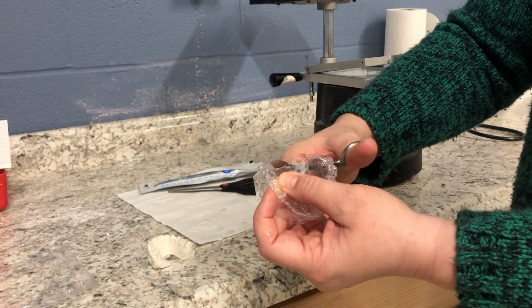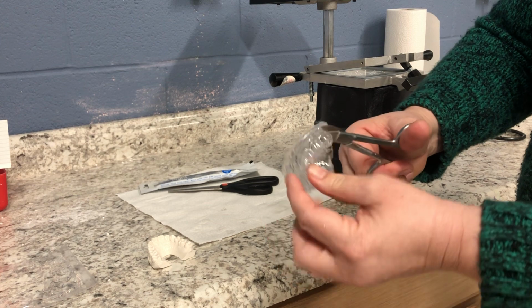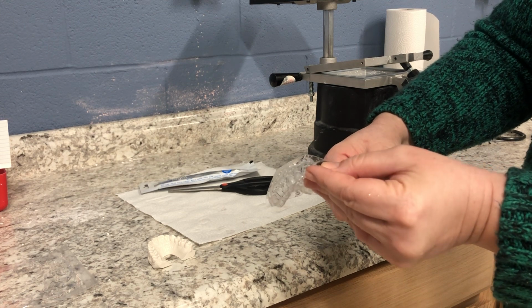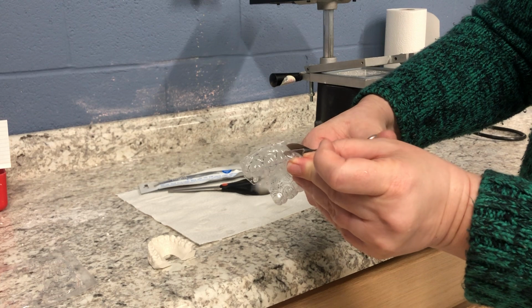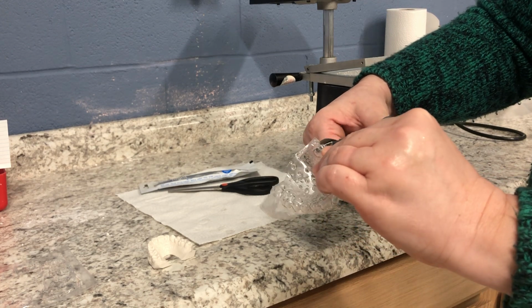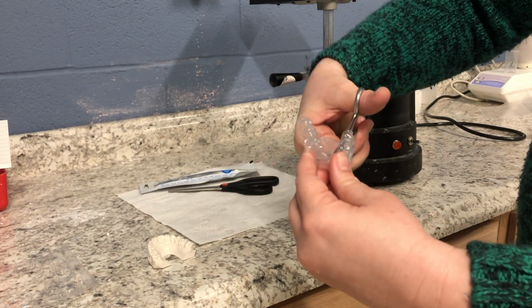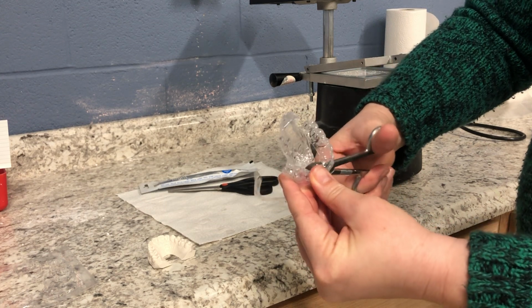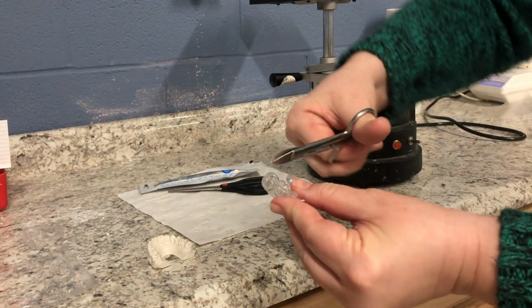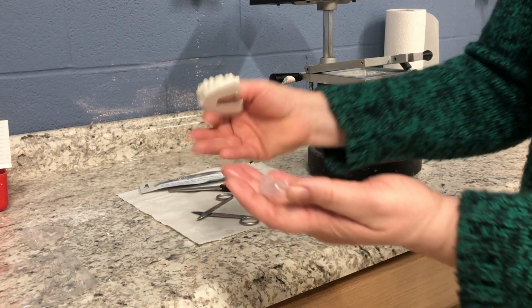I want it directly on the tooth, so I'm going to cut just a little bit of that distal away so it's just tooth. And then right above the gum line, I'm just going to follow that along the gum line, about 1 millimeter above it. Then once I get to that other molar, again, just right there on the distal, cutting around, trying not to touch any more of the palate than I have to, and making sure that when I trim, it's going to be nice and smooth. Okay, so there's your bleaching tray for the upper.